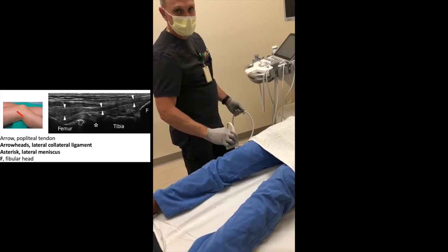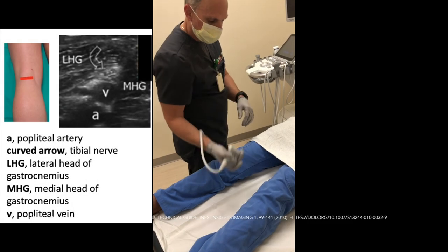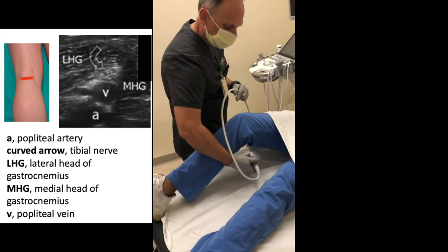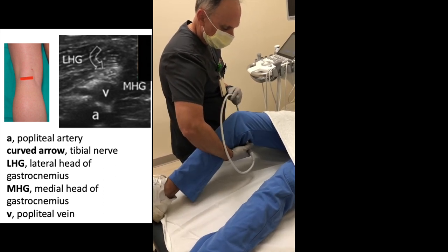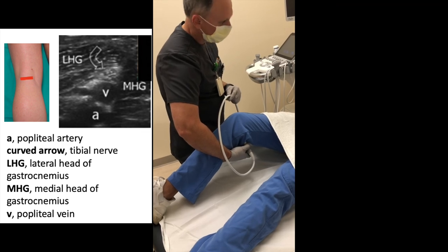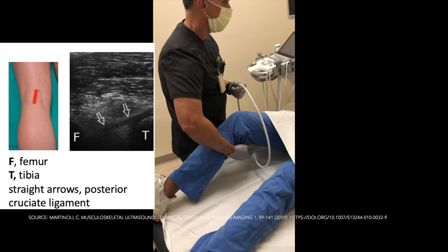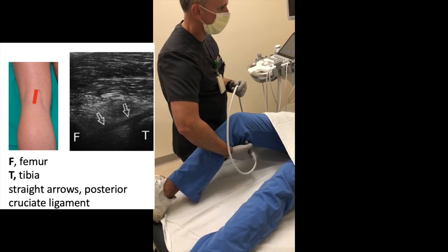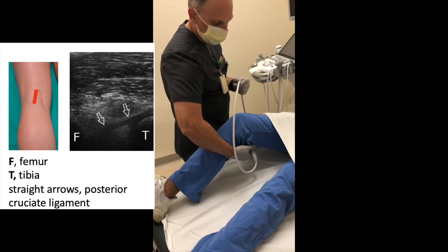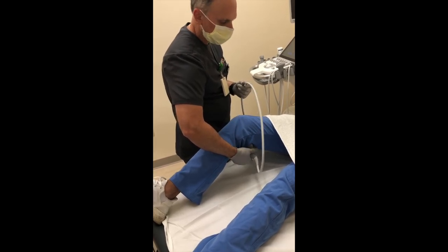While we're doing all this evaluation, we're also looking for effusions. Then I'd like to finish off with the posterior. We go short axis to look at the popliteal fossa. We look for our Baker's cyst in short axis and long axis. While we're there, we also evaluate to make sure there isn't a popliteal vein clot, so we also look for DVT in short and long axis.